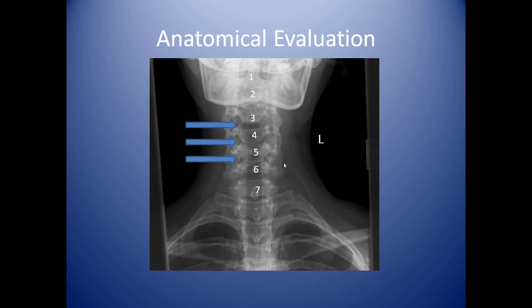The primary reason for the arrows is so you can see the intervertebral spaces to evaluate image quality. You want to go higher than the dens — that little dome — rather than cutting it too close. In this example, the technologist included coverage all the way down to T4, which makes this a good examination.